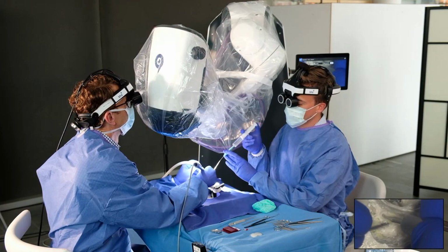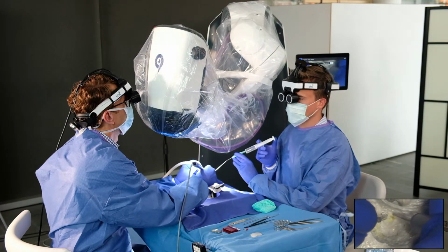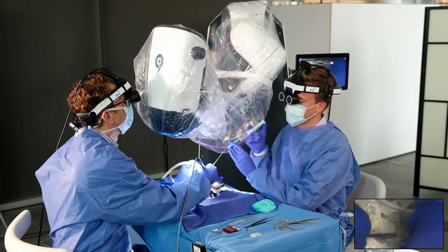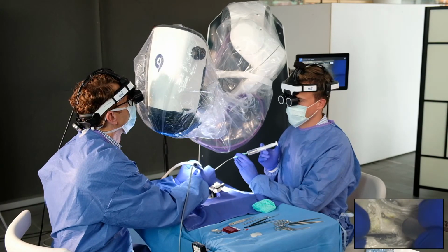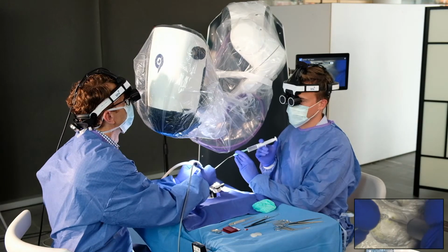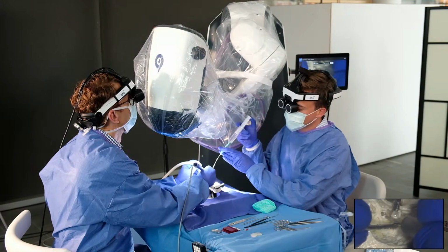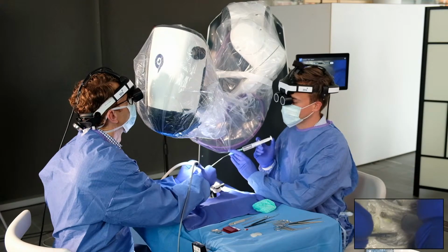How is the depth feeling? Do you have a good orientation inside the mastoid, or is it different? No, it's a perfect view, and I have a perfect feeling of the three dimensions of the mastoid bone. Actually, our model has a slightly different 3D angulation, and that's why the depth is a bit higher compared to optical microscopes, and should give a more intense feeling with this type of system.